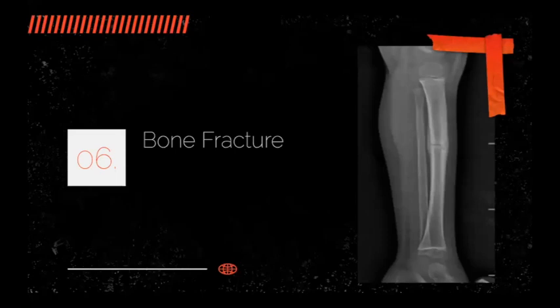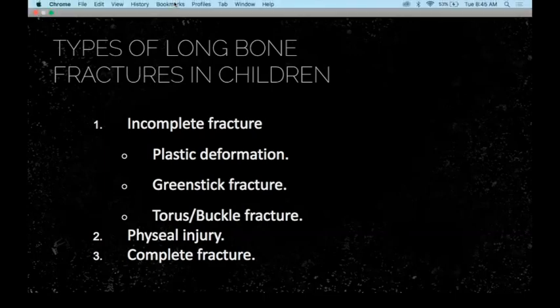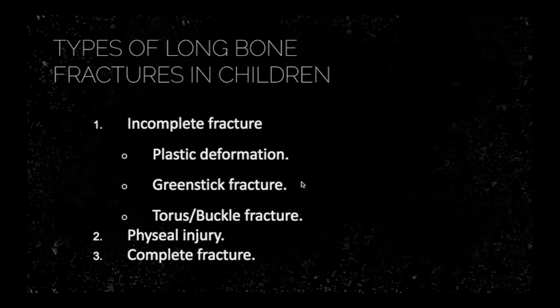Right, now we move on to another big chunk of this presentation, which is bone fracture in pediatric cases. I will go through the types of long bone fracture, and then we go through some of the common bone fractures in pediatrics. Okay, so long bone fractures can be divided into incomplete or complete, as well as physeal injury.